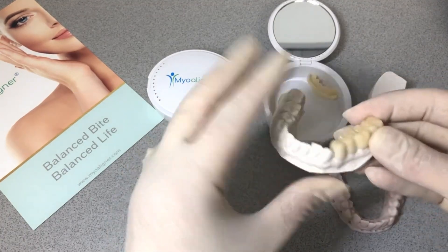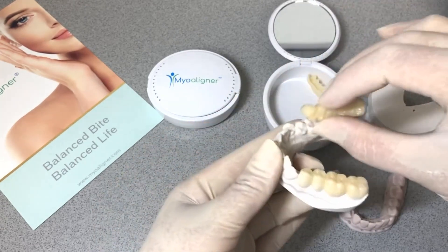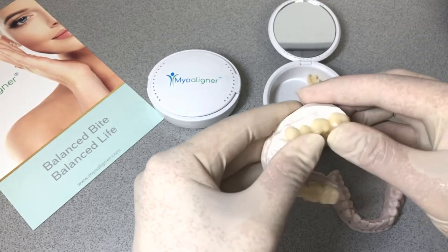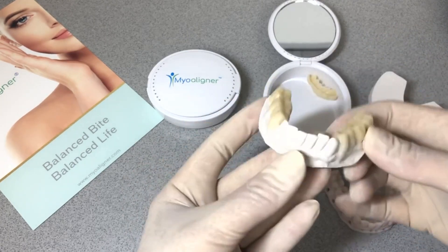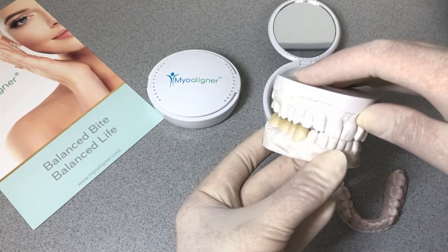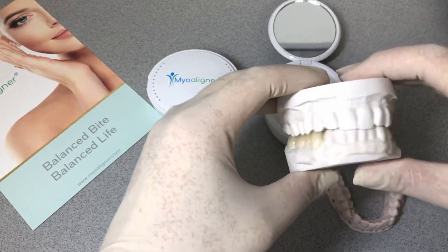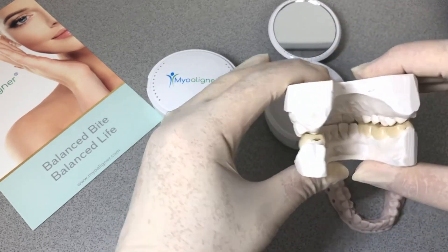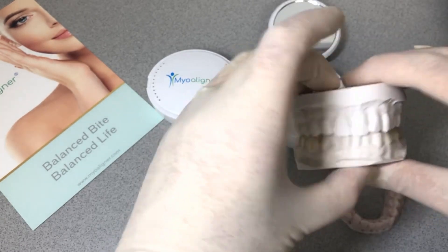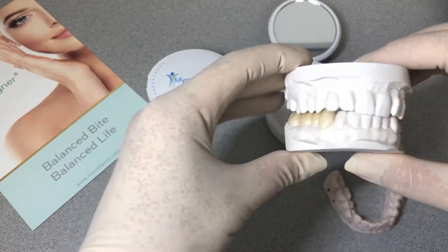This doesn't take any tongue space, follows the curve of occlusion really nicely, and allows the patient to chew and function with it for a few months and get some relief from TMJ pain and muscle spasm, while they're going through phase one orthotic therapy and hopefully correcting tongue posture and the alignment of their neck and posture on their way to phase two.